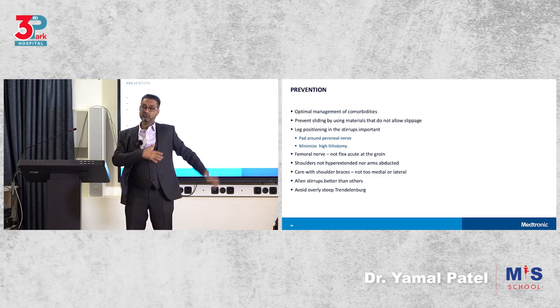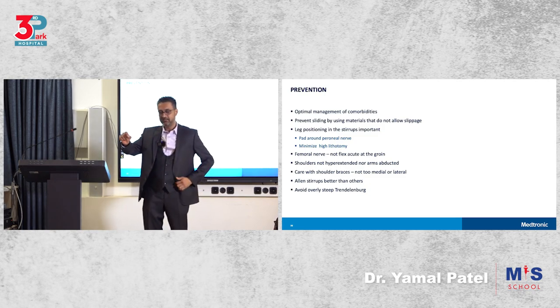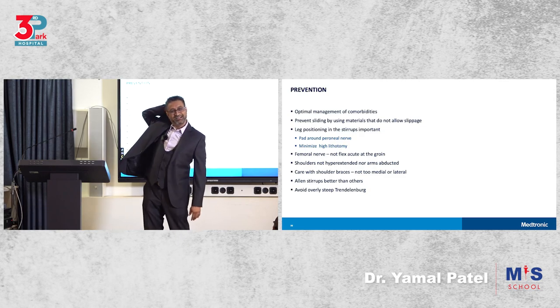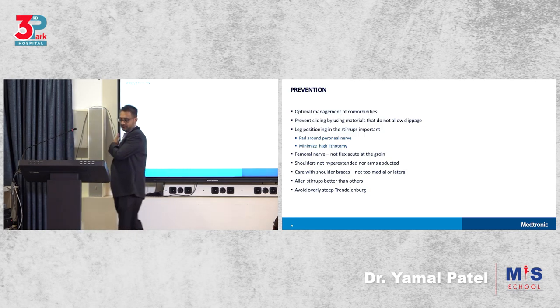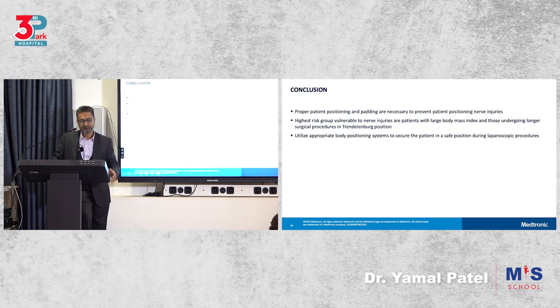Don't do that. They are supposed to position them on the side of the patient with an extension lining that you can then have on the side, and they're tucked in. You've understood? Or if you want, then this might be okay. But you can't do this. You can't go above that angle. You'll injure this place. Then Allen stirrups, and avoid a very steep Trendelenburg, especially if you don't have anti-slip mechanisms in place. In conclusion, the positioning and padding are necessary to prevent injuries.